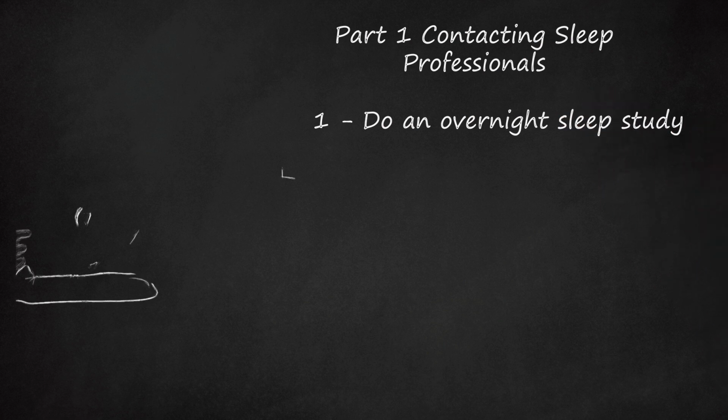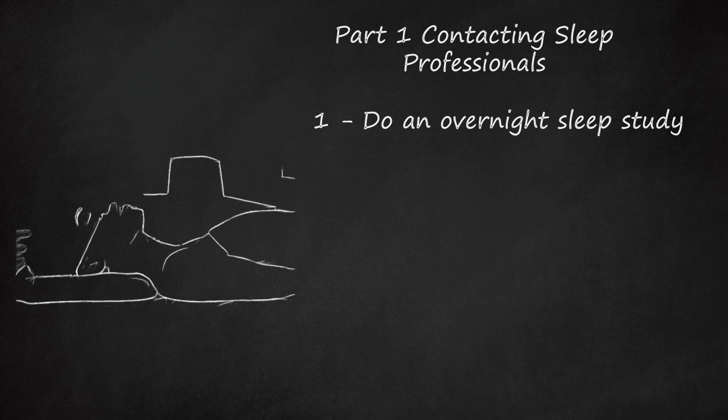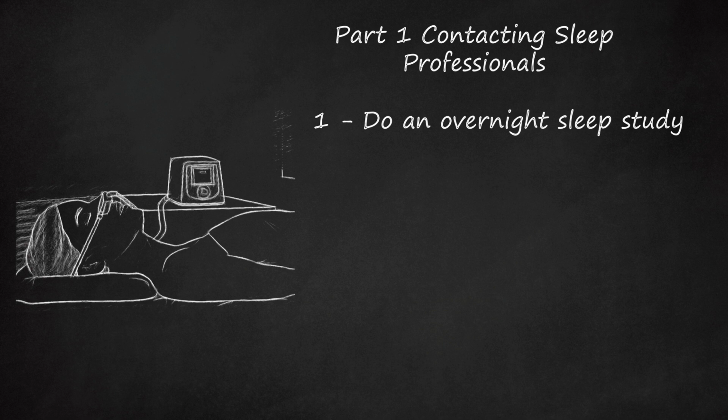When you sleep overnight in a specialized sleep laboratory and get diagnosed with sleep apnea, the team of doctors will determine what the optimum average constant pressure is for you on your CPAP machine. The process by which they figure out the most appropriate air pressure is called a titration study. A titration study is done with a mask and air machine for the purposes of calibrating a CPAP machine to a level that stops your sleep apnea events.